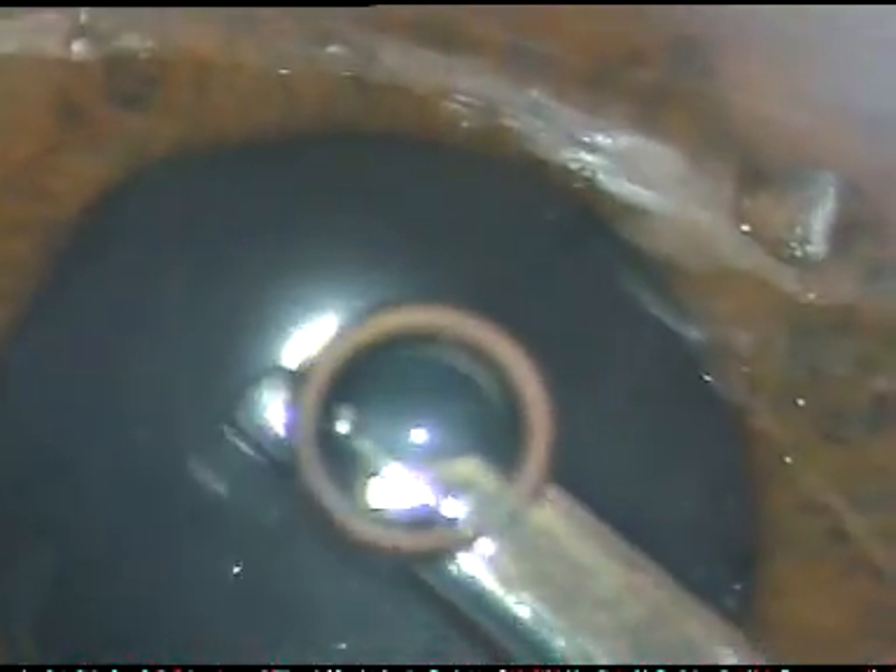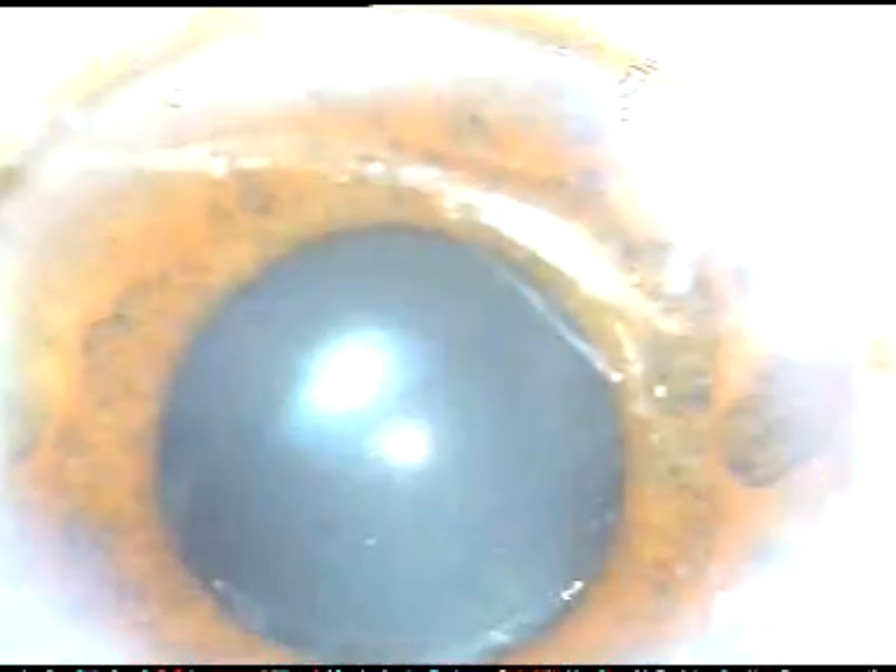So I was lucky enough in this case not to have nucleus drop and managed the case nicely. Hope this video will help you in your practice. Thank you very much for your attention.